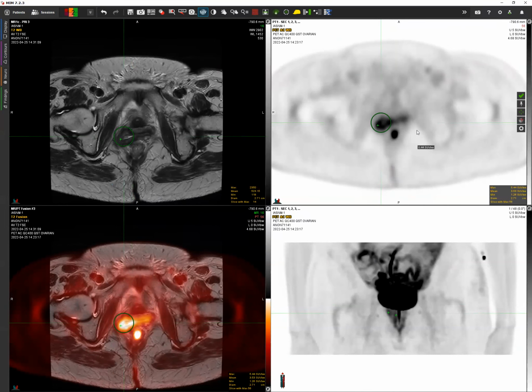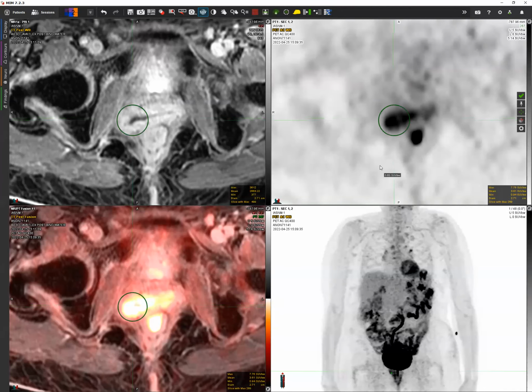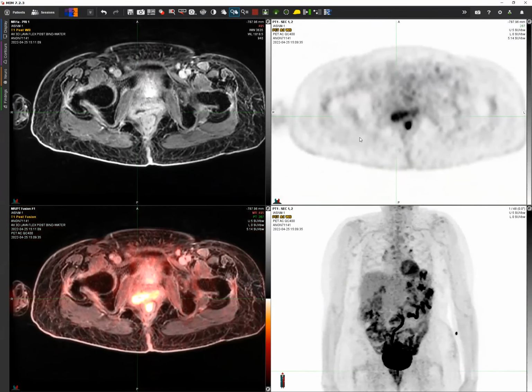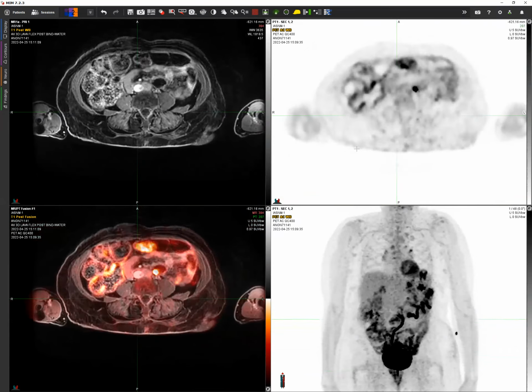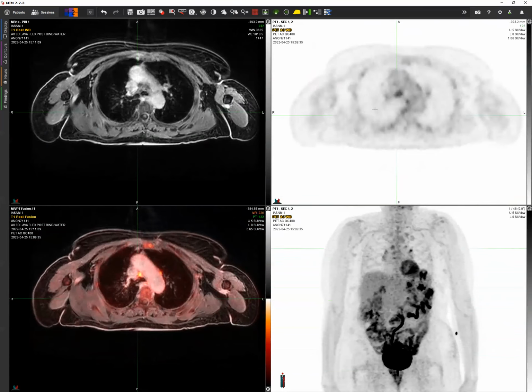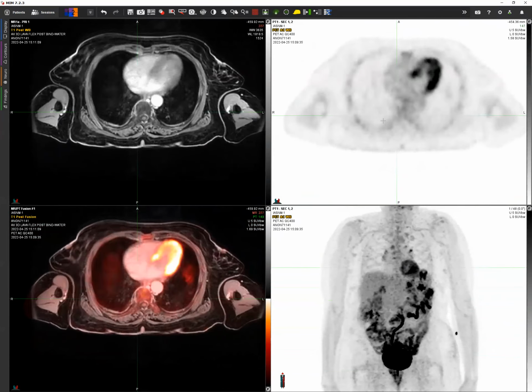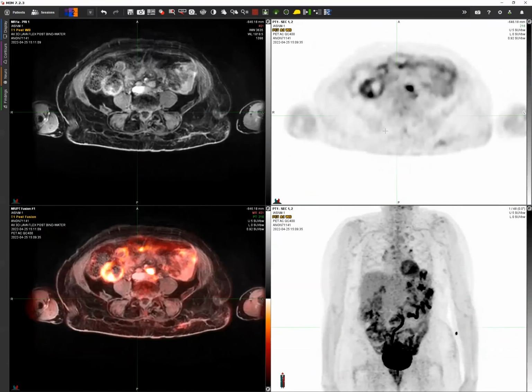So this is that same region, right? This one was acquired at 60 minutes post, 5.4, and our whole body post right here, 7.8. So that's where we talk about, oh, that's probably recurrent disease or residual disease as opposed to inflammatory change. And as you scroll through, it's fairly responsive. So MIM has a decent program, but I think the one thing that they need to work on is memory management, and hopefully we continue to work with them to get that fixed.